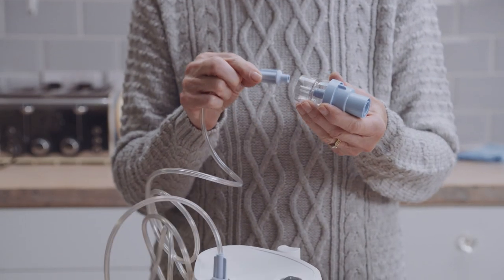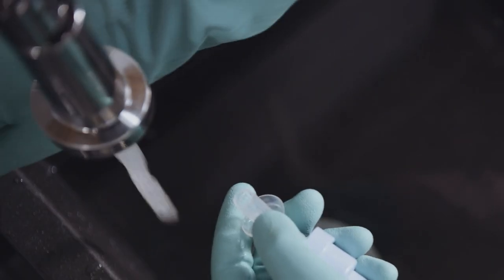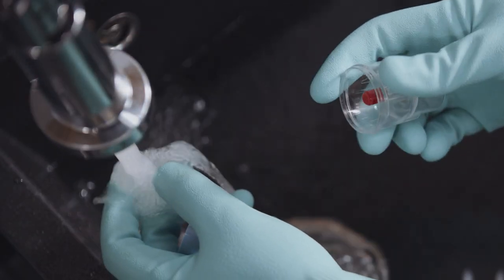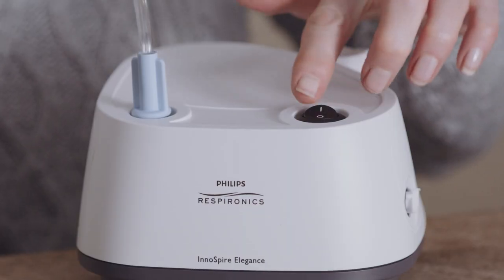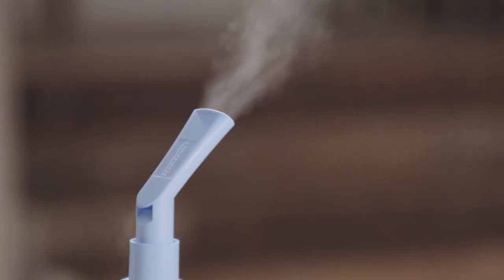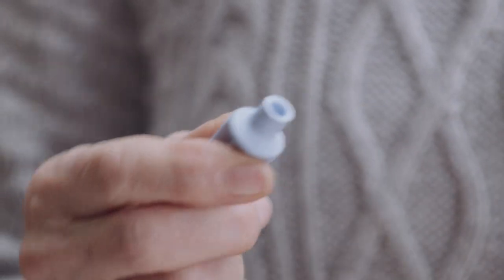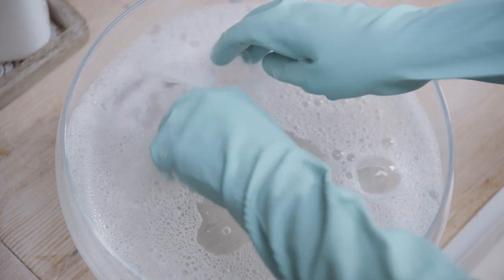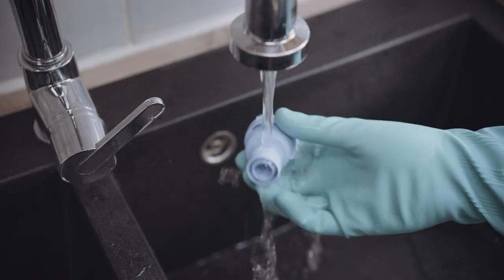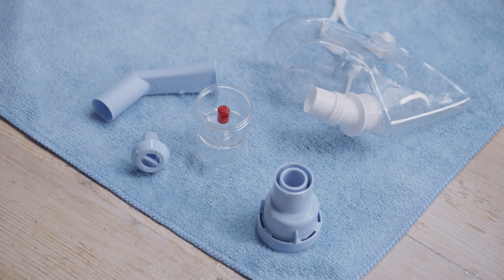Disconnect the Sidestream from the tubing. Unscrew the top from the medicine cup. Rinse out the nebuliser and refill with clean water. Reassemble the top and medicine cup. Reconnect the tubing and run the Sidestream again for a few seconds to flush out any drug trapped in the nebuliser jets. Disconnect tubing from the medicine cup and wash all items, apart from the tubing, in hot soapy water. Rinse all parts in clean water for two minutes. Shake off excess water and allow to air dry. Do not towel dry.